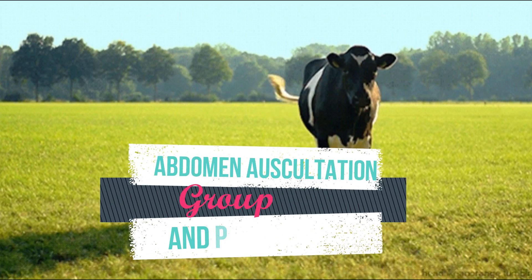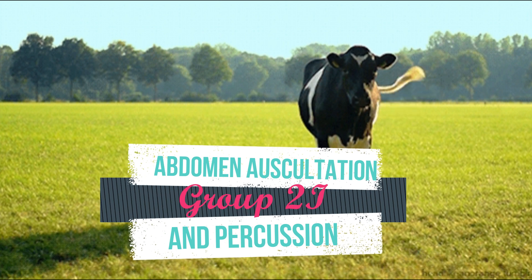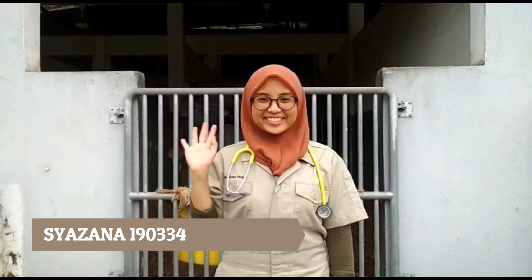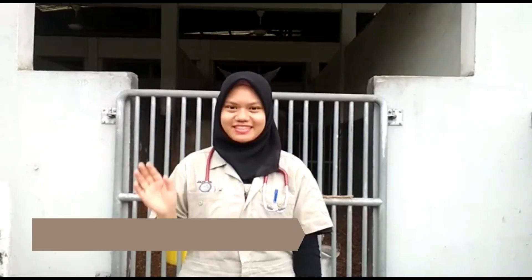We are from group 2i and we will demonstrate how to do the abdomen auscultation and percussion. Our group consists of Kalisah, Shazana, Akilah, Najwa, Jasmina, Darina and Azila.